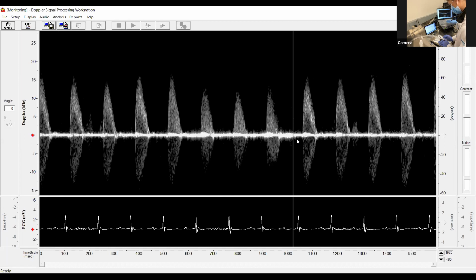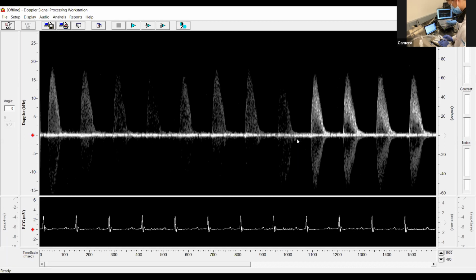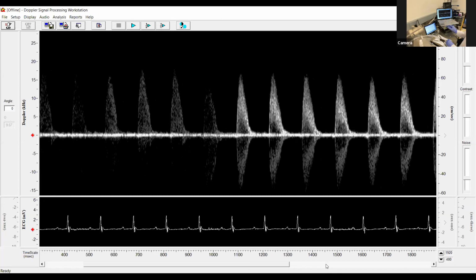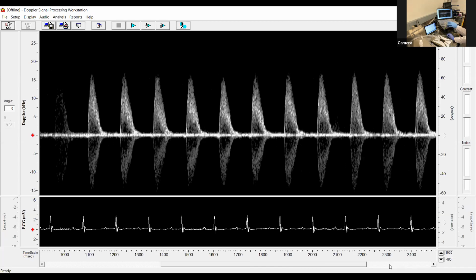Okay. There we go. Okay, so that looks really nice. I'm just going to scroll over. Thank you. Perfect. Okay. I'm operating Sydney's computer and she doesn't have the tap that I'm used to with my trackpad. So we will work with this.